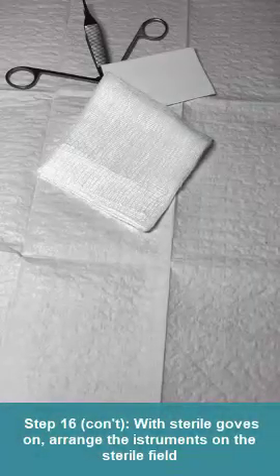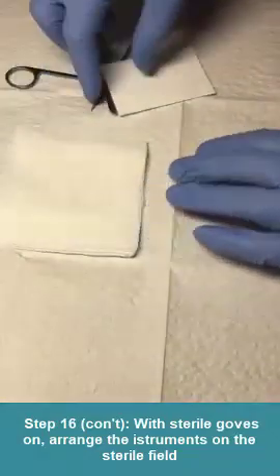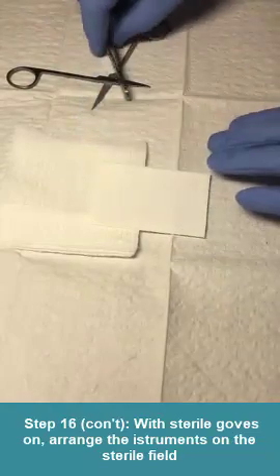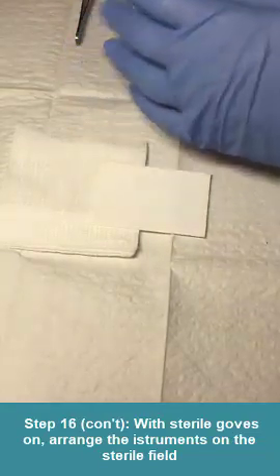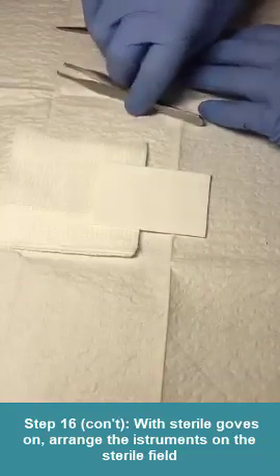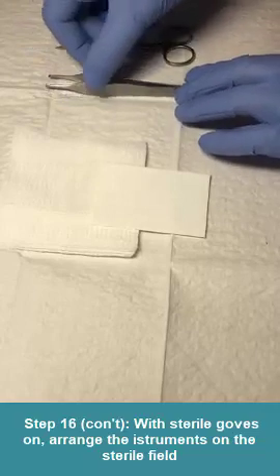Now we're back to our sterile field. I have on the sterile gloves now so I can arrange my instruments. I'm going to put my pads to the side here. And the provider probably has a manner where she does these arranged, so I will do it that way, pretend like I'm doing it that way.